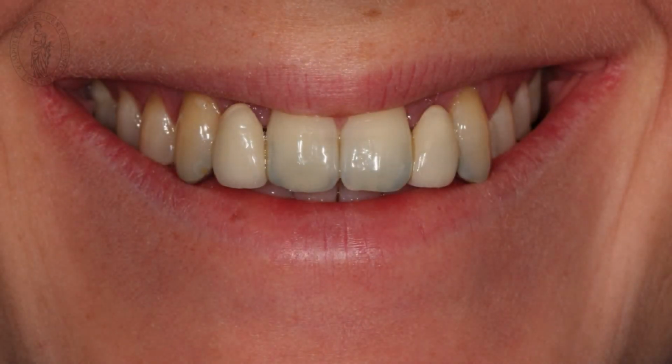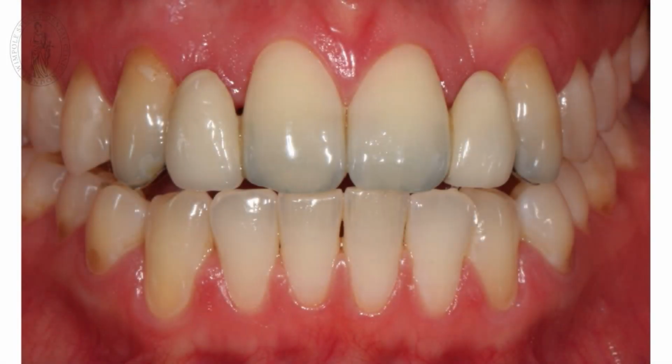Last case, I think, for today. You can see that it is important that you always choose the right materials. In this case, the patient had a Maryland bridge done with another dentist, and he used a metal framework. And you can see the metal framework is shining through the teeth, and the teeth are discolored because of that metal framework. So of course this is not a situation for a 22-year-old girl.